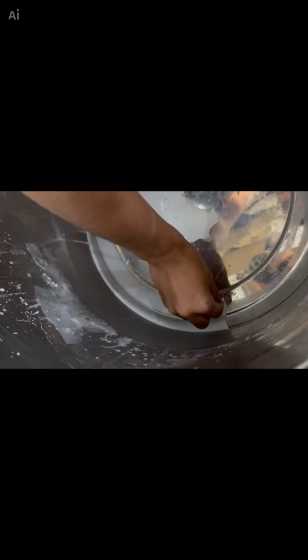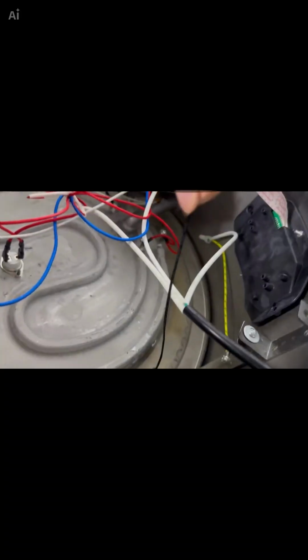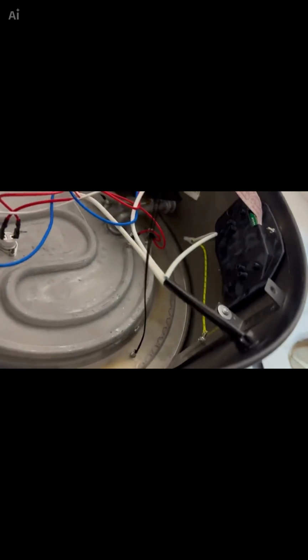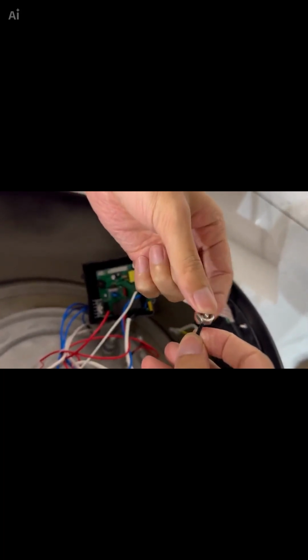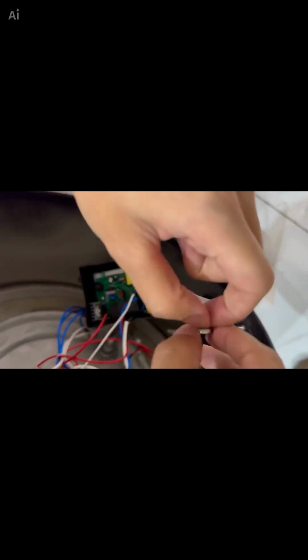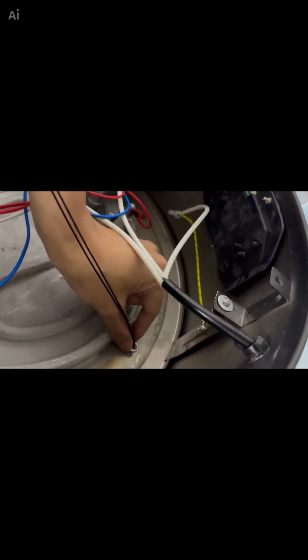Okay, after threading it through like this, place it at the bottom, place it at the base. Then come to the back of the cylinder here and hold it with your hand. Hold it tight. Then pass this nut through the wire here. Okay. Then use your hand to tighten it a bit here.